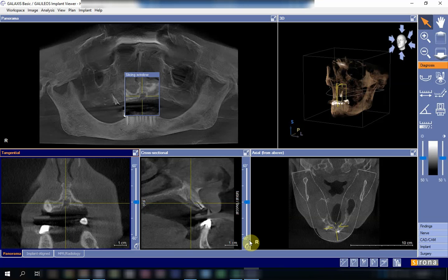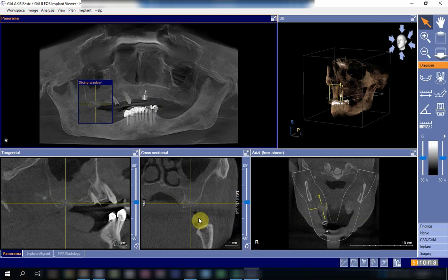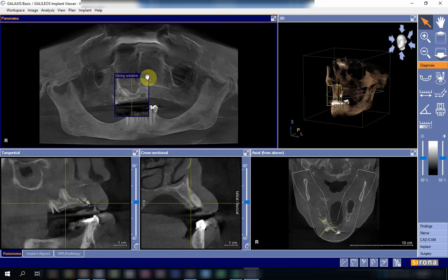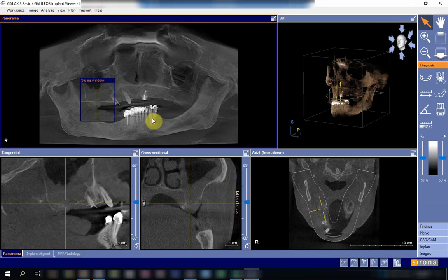This overcomes the problem of two-dimensional images seen in the intraoral and the OPG. This is a case of a patient who came to extract a retained root in the upper posterior area, and unfortunately the tooth was removed forcefully, which led to the problem of oral antral communication.